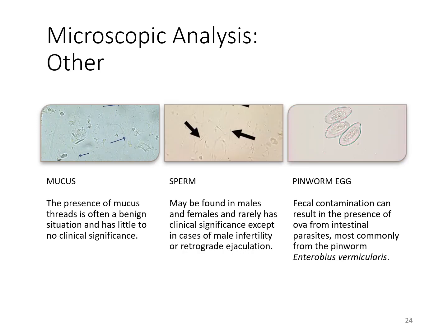Mucus, of course, the urinary tract is a sort of mucous membrane, so it isn't uncommon to see mucus strands within the urine. You just have to be careful not to confuse those with casts. You can see sperm in both males and females. Typically you're not going to report sperm unless it is something significant like a young child.